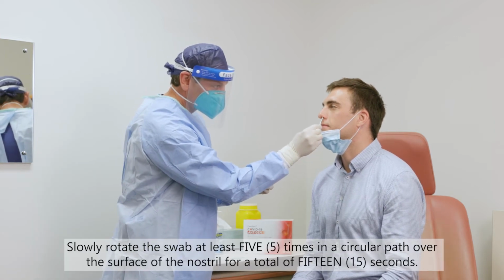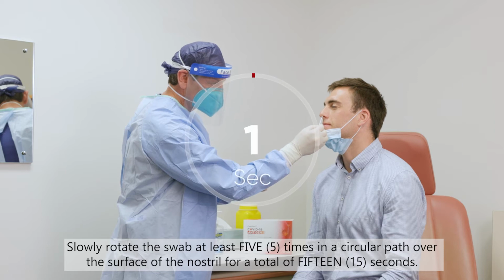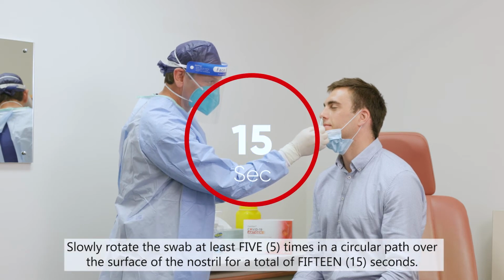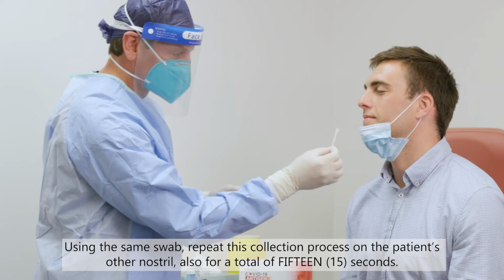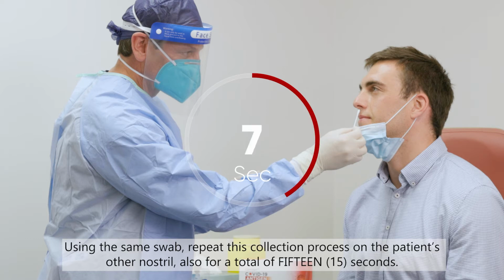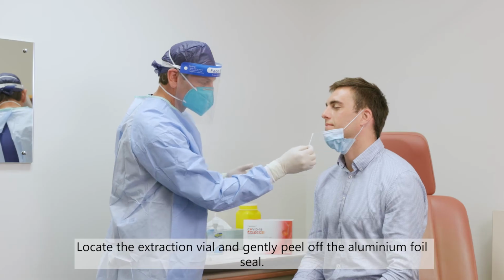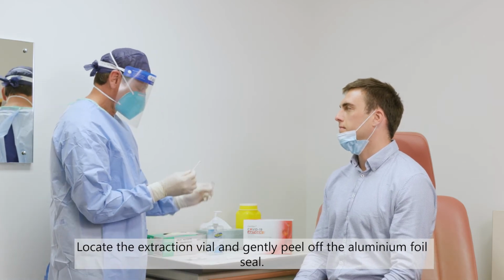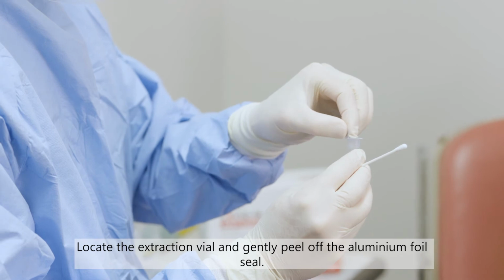Slowly rotate the swab at least 5 times in a circular path over the surface of the nostril for a total of 15 seconds. Using the same swab, repeat this collection process on the patient's other nostril, also for a total of 15 seconds. Locate the extraction vial and gently peel off the aluminium foil seal.